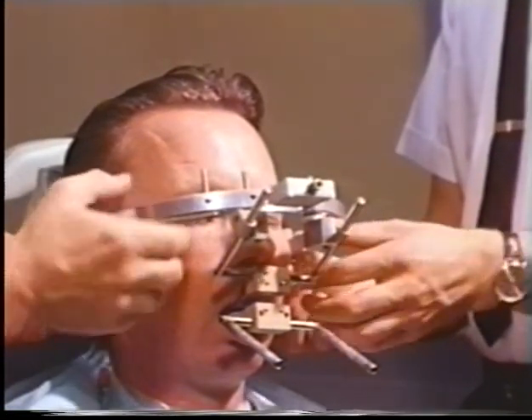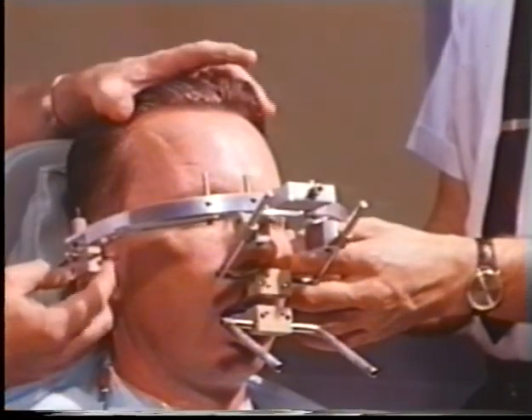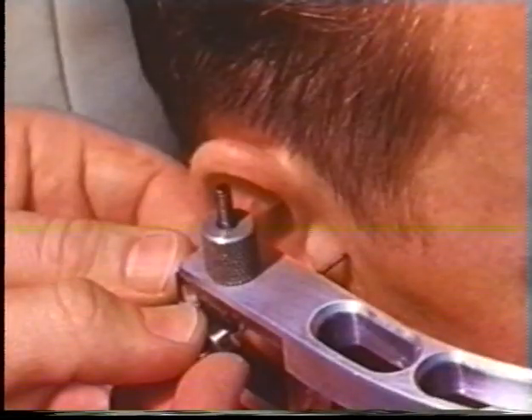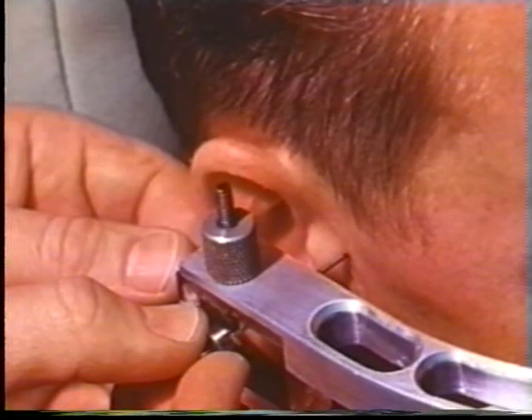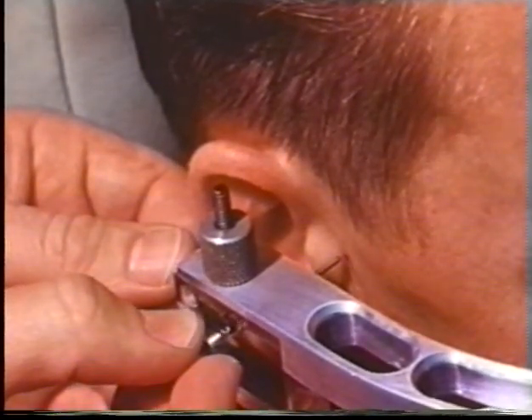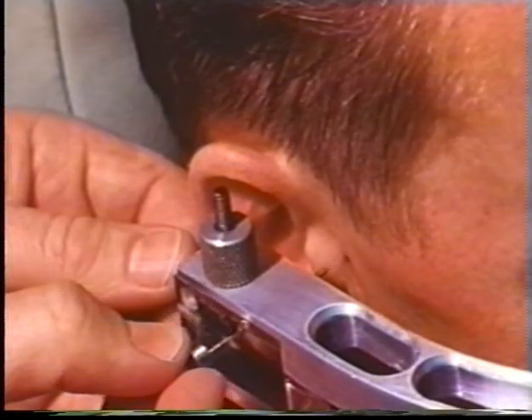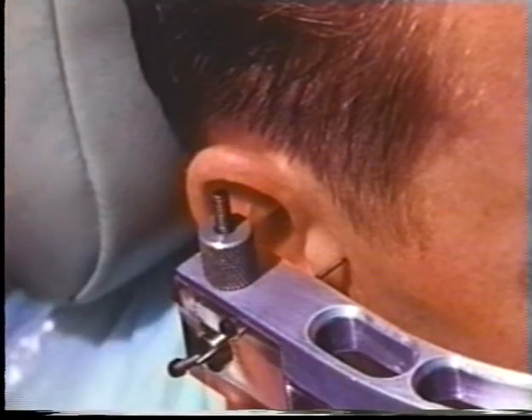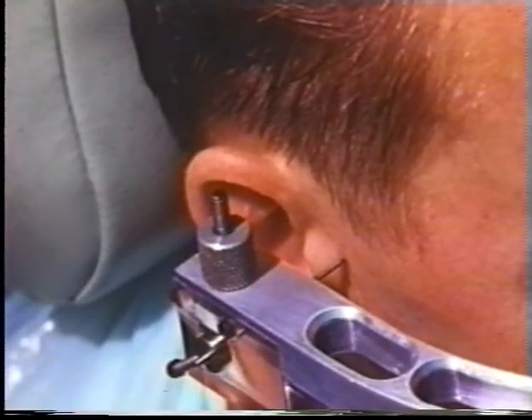While the plaster is setting, the points of the two alignment pins are held to the axis spots which have been previously located and marked by conventional methods. This procedure not only centers the bow on the patient's head, but also orients it so that the axis of the two alignment pins is collinear with the hinge axis of the mandible in centric relation.